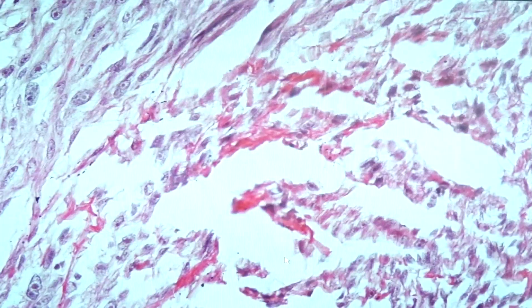It would originate from fibroblasts, and you can see the presence of spindle cells. There would be atypical fibroblasts, which would be different from the other fibroblastic nuclei. Here you can see prominence of the nucleoli. So these are atypical fibroblasts.